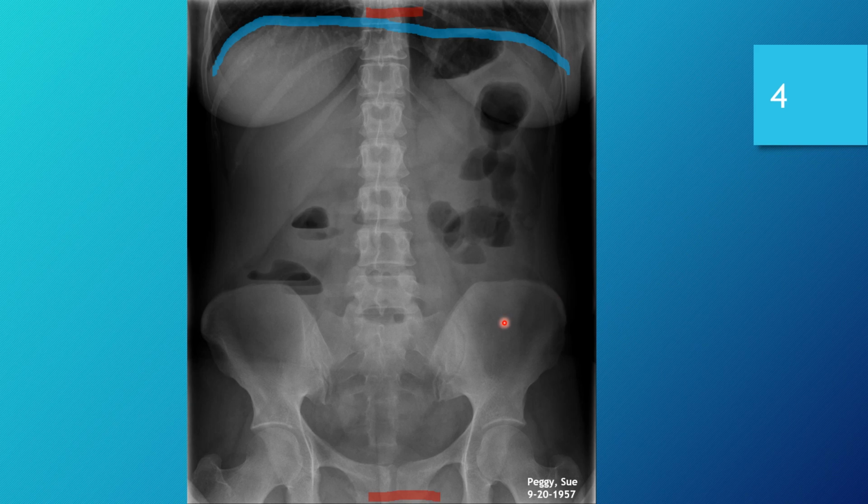And then, of course, this patient was, I would have to say, probably a little on the smaller side, because the entirety of the abdomen and pelvis is visible in this exam.